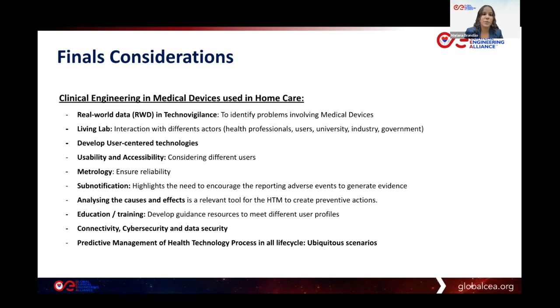We can also consider the metrology, given the many notifications about medical devices in the different public databases. We have many different causes, for example, problems about metrology specifically in medical devices. So we need to consider metrology to ensure reliability in medical devices.